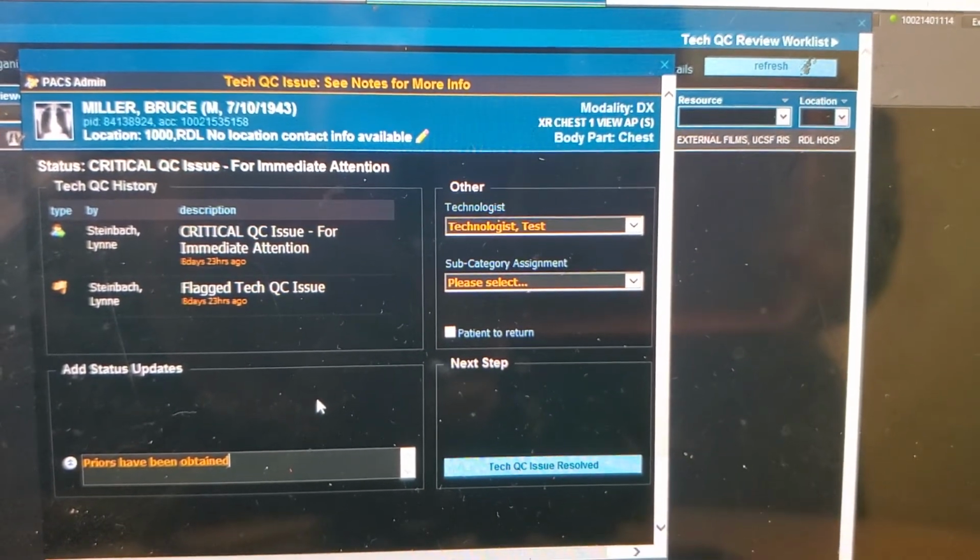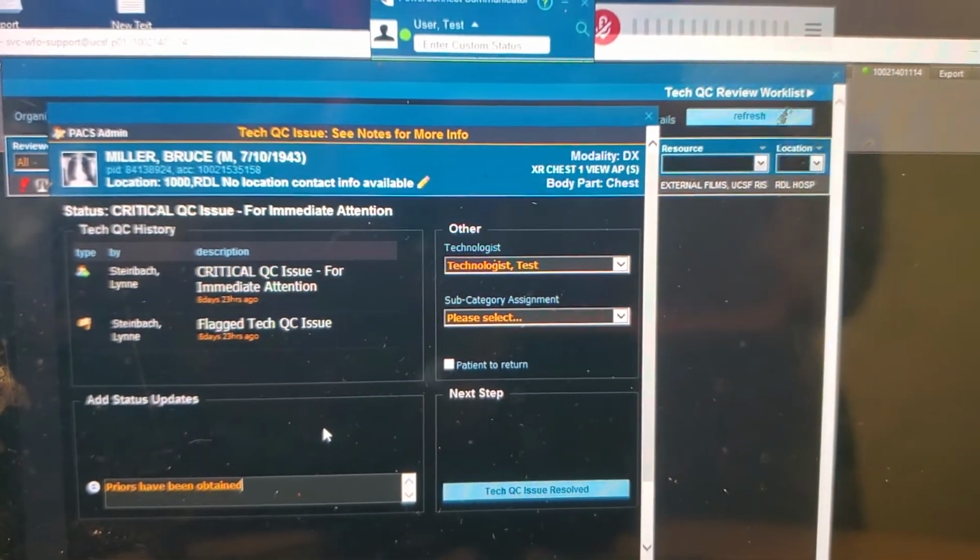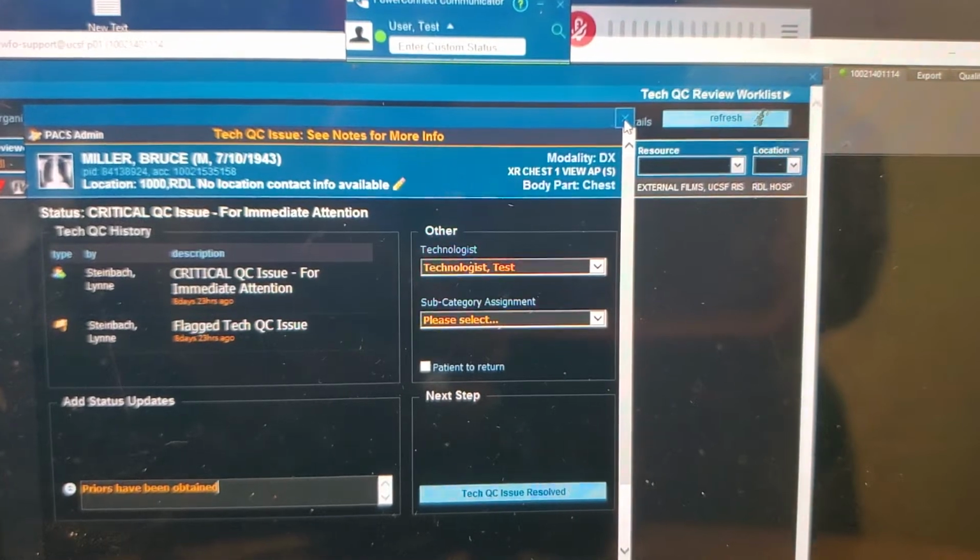Questions I can answer? Feel pretty comfortable with resolving tech QC issues?